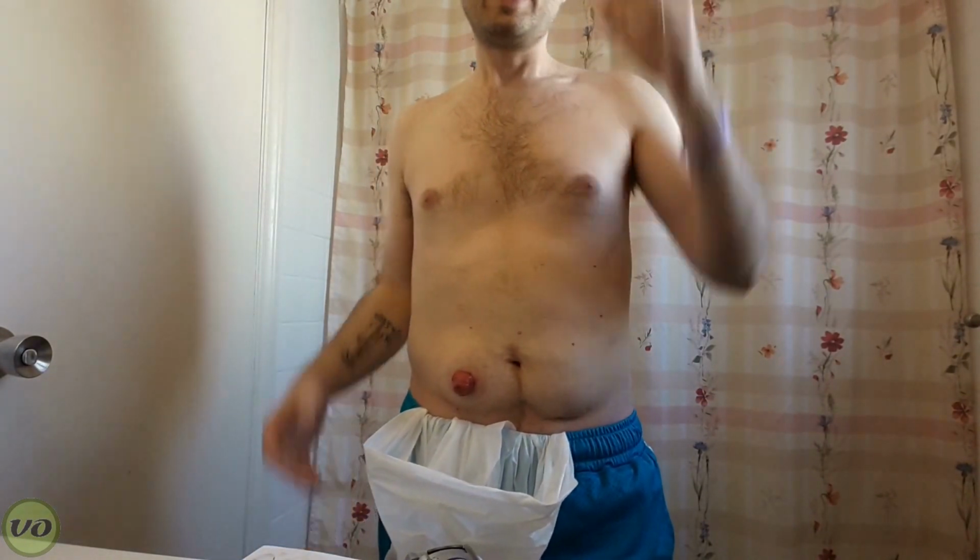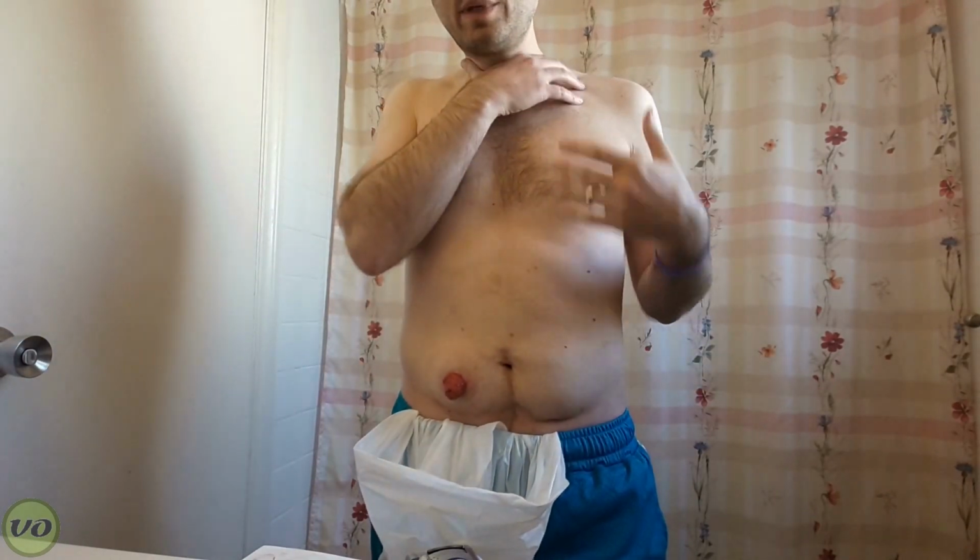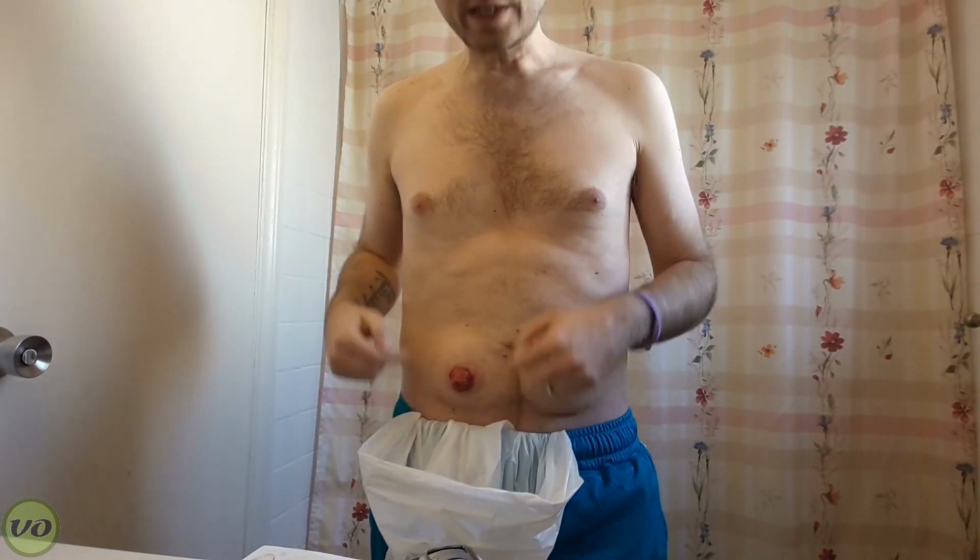So once everything looks good, you're ready to go to the next step. Now, for some people, this might be all they need to do. They can just put their appliance on right after that. But I'm actually going to be using a barrier ring because I do get a bit of redness around my stoma, and I'd rather just take care of that rather than have it become a problem further down the road.